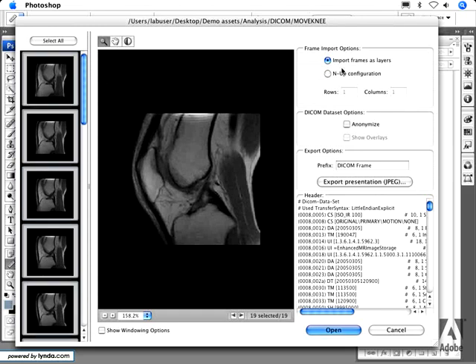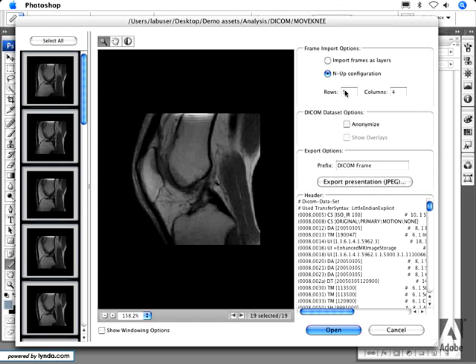There are other options for how to bring these frames into Photoshop as well. For example, one option is to import the frames as individual layers in Photoshop, so each frame would become one Photoshop layer. The second option is to import them in an NUP configuration — if you have 19 images and want to create one layer with a tile of images, you can specify five rows and four columns.